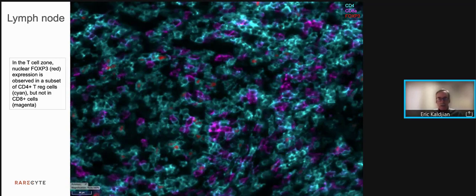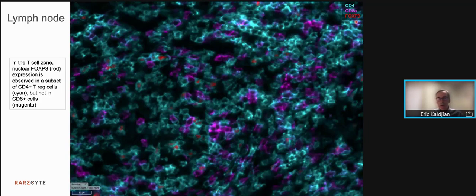Activation states can also be assessed using markers of cellular physiology. In this case, we have two different markers of proliferation — PCNA in red and KI67 in green. There are relatively few proliferating cells, and these are confined to B cells; they're not present within the T cells in magenta. PD1, the checkpoint exhaustion marker, is also present — you can see that in light blue. T cells have various subsets. This slide shows the CD4 and the CD8 subsets in cyan and magenta, interspersed within this T cell zone. We can also look at the T regulatory subset, FOXP3, which is a nuclear marker — seen in red in a few scattered cells. These cells are CD4 positive, not CD8 positive.